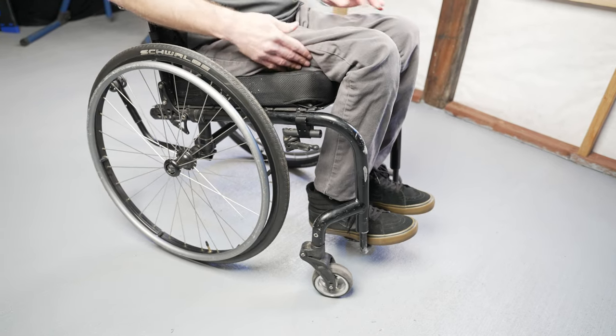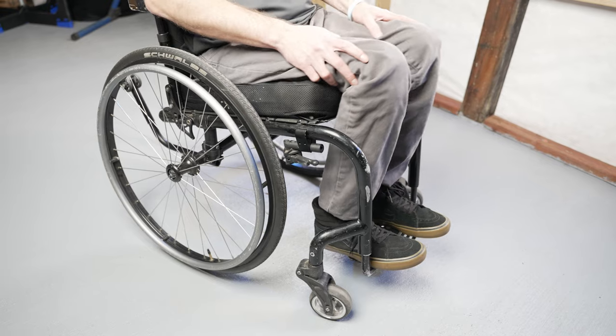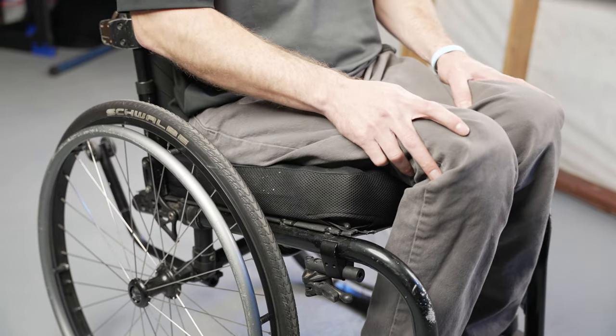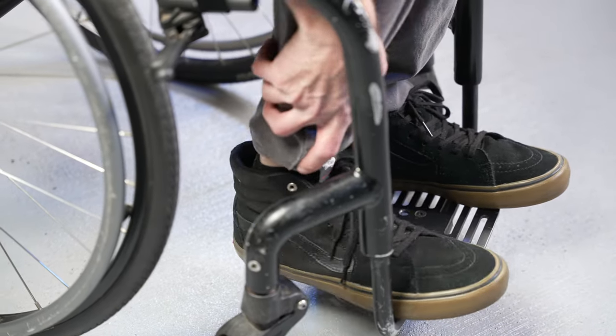To determine if you need to raise or lower your footplate, while sitting on your cushion you should check the support behind and under your knee and underneath your femur. If your knees are easy to move side to side, you should try to lower your footplate. If your legs feel like they are hanging and your foot isn't sturdy on your footplate, then you should try raising your footplate.